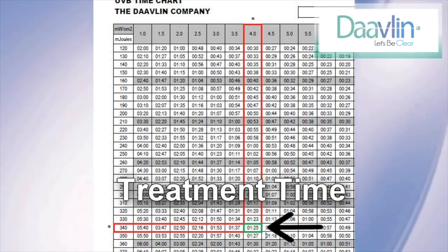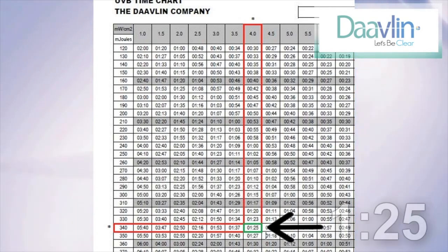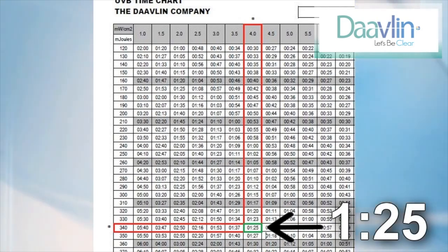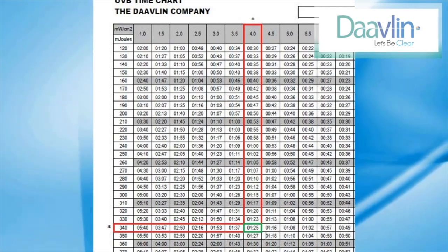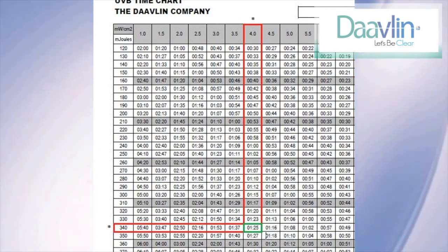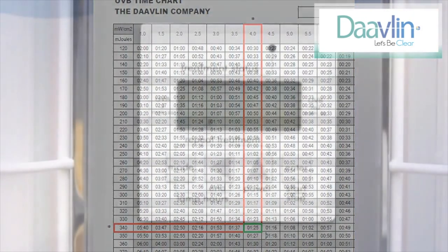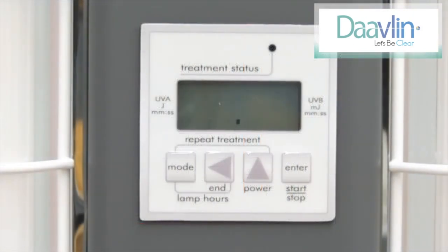In our example, a power output of 4 and a dose of 340 millijoules intersect at a treatment time of 1 minute and 25 seconds. Once you have calculated your treatment time, you are now ready to program your treatment.